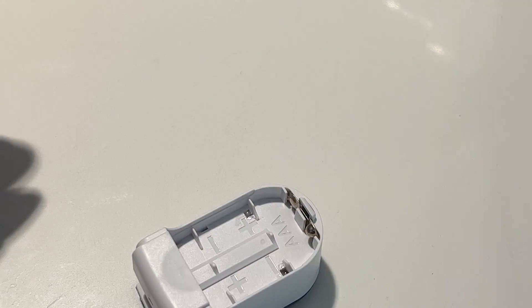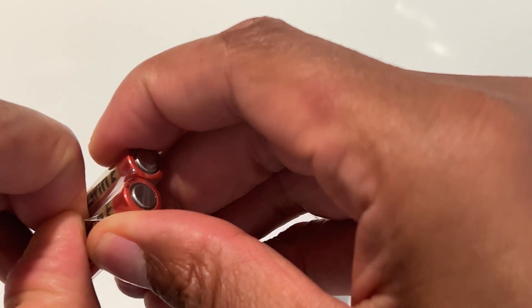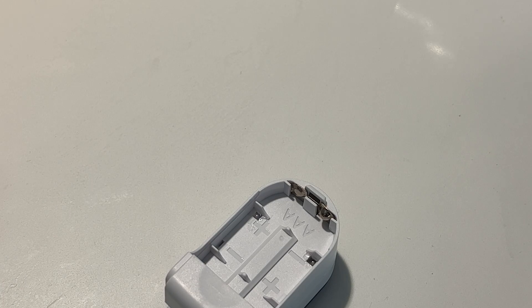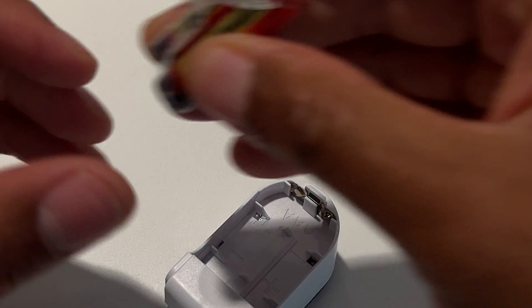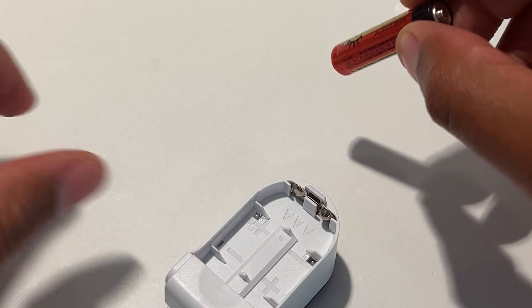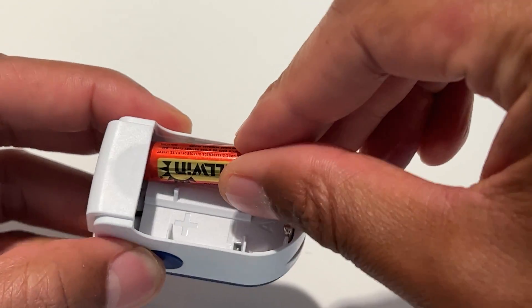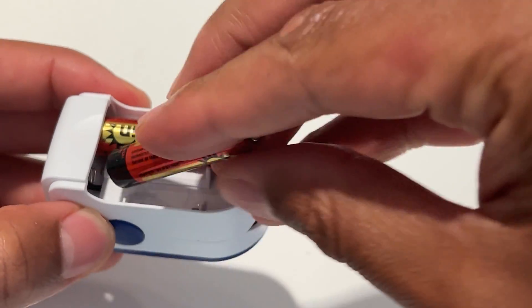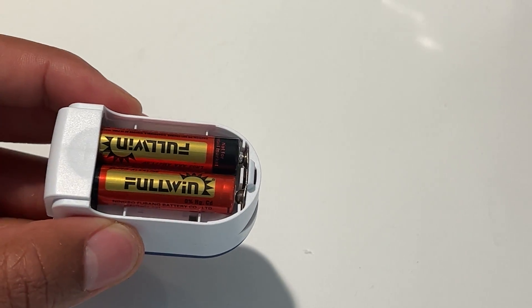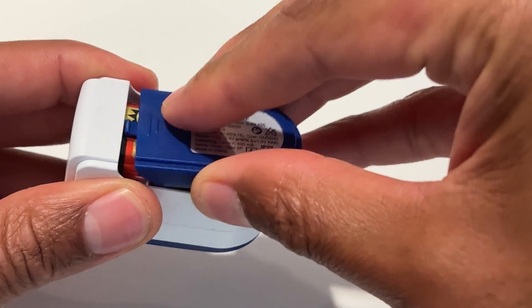And there are the instructions. The battery comes wrapped tightly in plastic — let me use my scissors to open that. I'm going to pull it back and place the batteries in. There are instructions on how to place them: the plus side going this way for one side, and the plus side going the opposite direction on the other side. Then I'll replace the cap and slide it back into place.